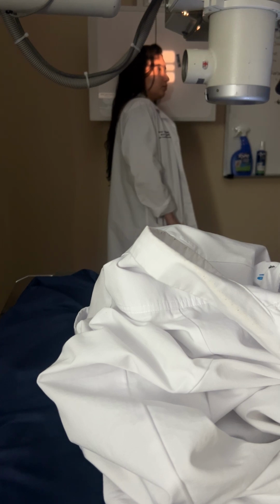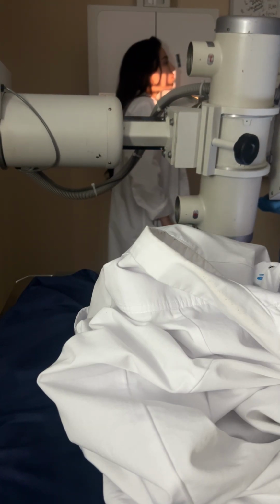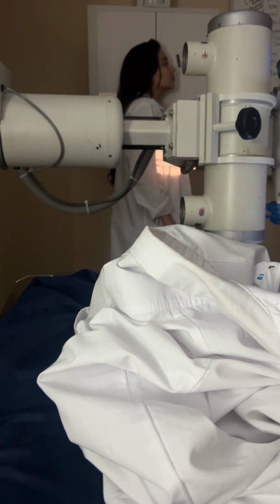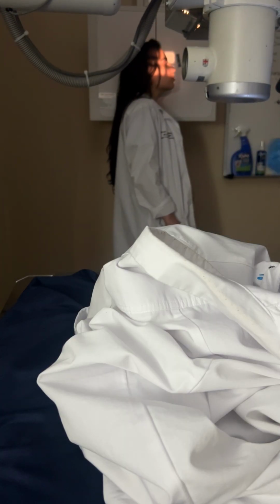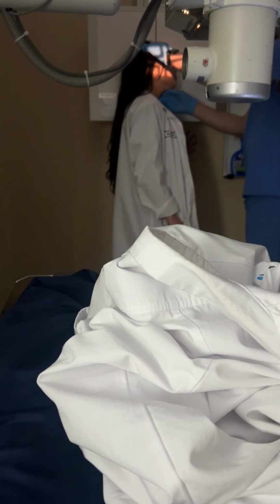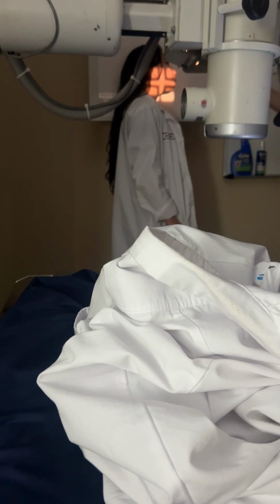And we have 2 options for your angulation as well. You can either come down, angle up 25 degrees through the side of interest, which would be the side closest to the IR, or you can keep your CR perpendicular and have your patient tilt their head over 25 degrees. And this is for the general survey?